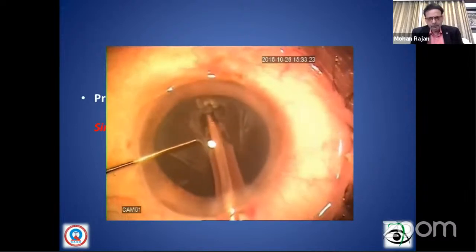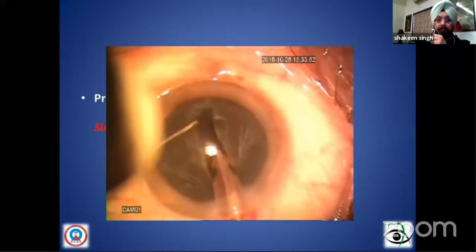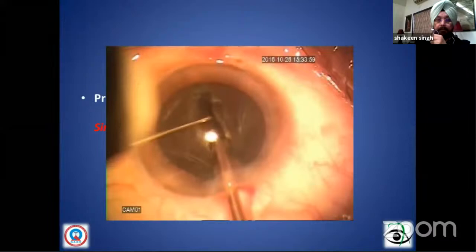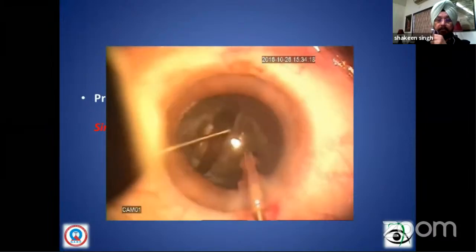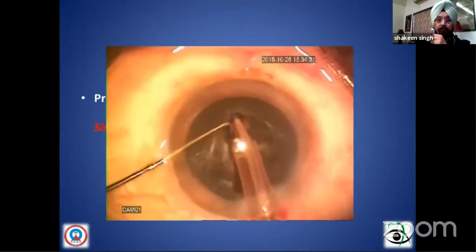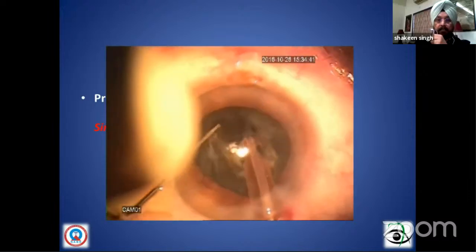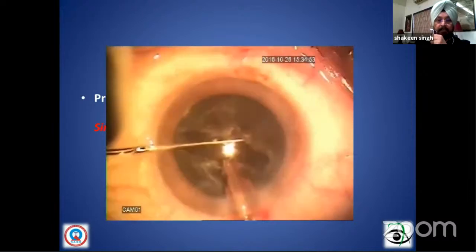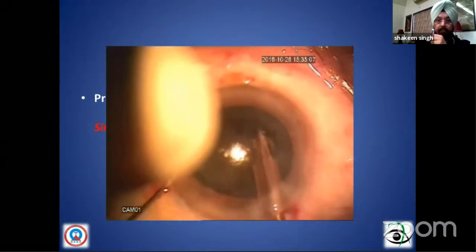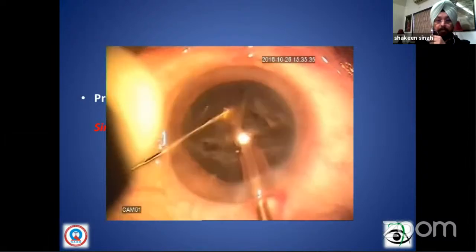Yes. So I'm going to reach the tunnel now. You have to have a deep trench, and my aim is to have a 100% break. So it's a deeper trench to reach the other side, and definitely understanding the physiology of the lens being deeper in the center, I would reach the other side, maybe with more length in the mid, then rotate and repeat the same onto the opposite side, breaking into 2 and then 4.